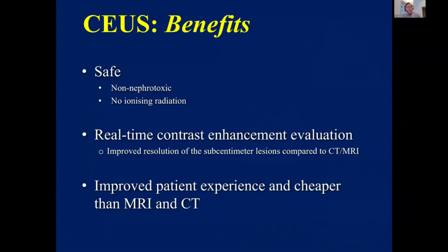So what are the benefits? Well, as I said before, it is non-nephrotoxic and doesn't involve any ionizing radiation. And when compared with CT and MRI, the real-time contrast enhancement evaluation, particularly in the 0 to 30-second phase, which you can't quite capture so well on CT or MRI, we can see it in real time, is really, really useful, particularly where there's improved resolution of the sub-centimeter lesions, which we see better on ultrasound than the other modalities. And of course, it's also a better patient experience, and it's cheaper than MRI and CT.